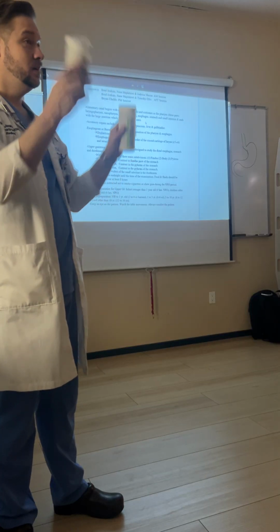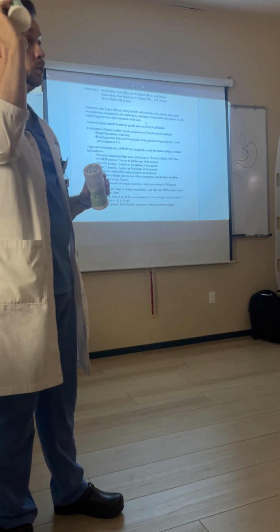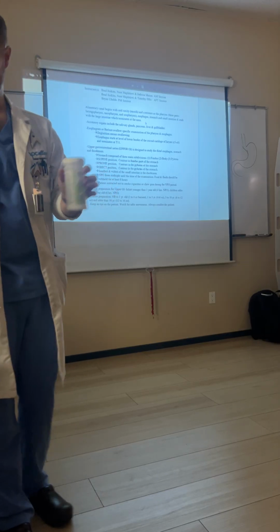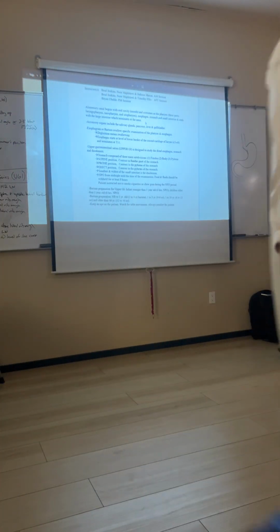Thin barium, thick barium. Thin barium flows like milk. Thick barium coats the inside of the esophagus and the stomach, okay? So take a moment, come over and feel the difference in weight between these two, okay?